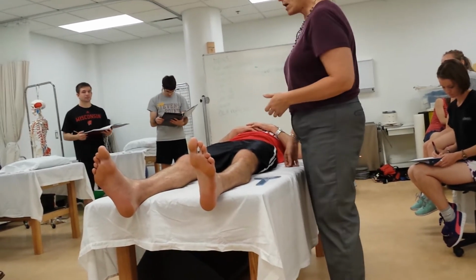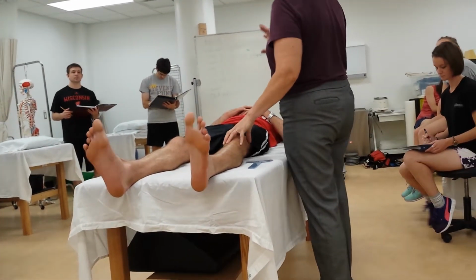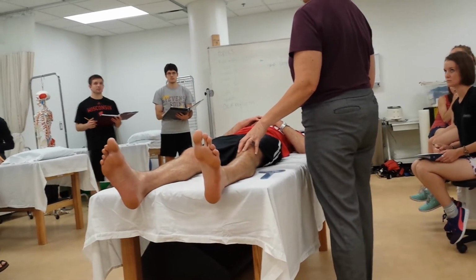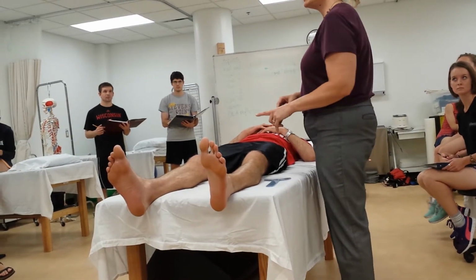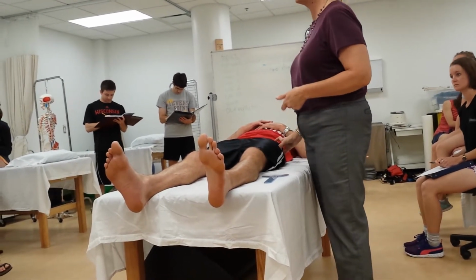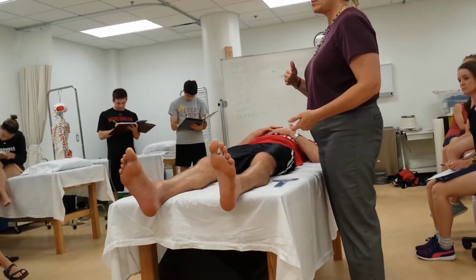Okay? Now, the other thing is when we're measuring hip flexion, goniometry, do we want his knee straight or bent? Bent. Why? That's the correct answer. Right. Hamstrings are going to be tight, and that might be limiting the motion. If we're just wanting to know what the hip motion does, we want to keep the hamstrings on slack, and so we're going to have the knee bent.